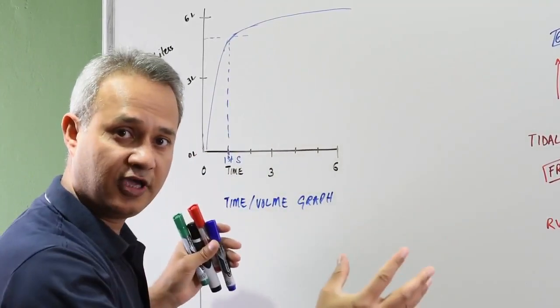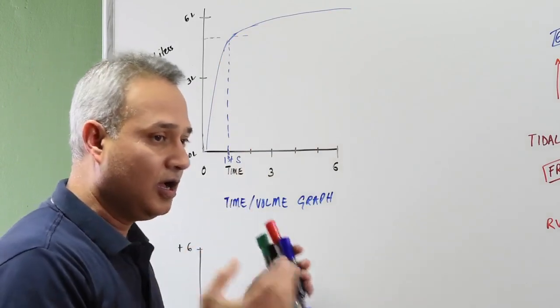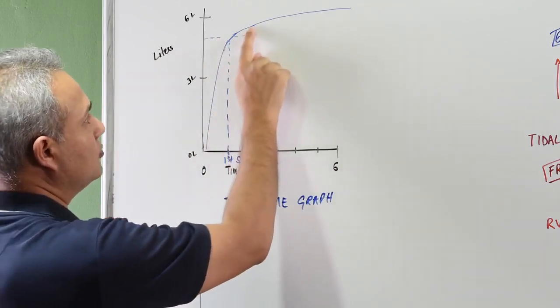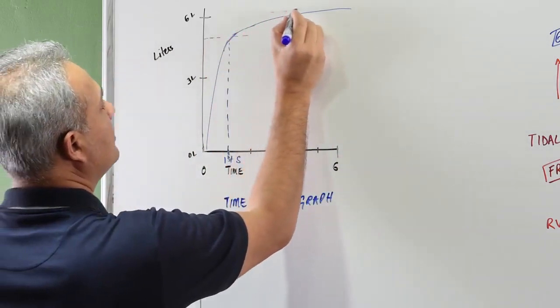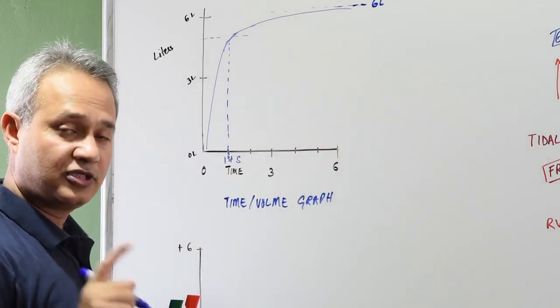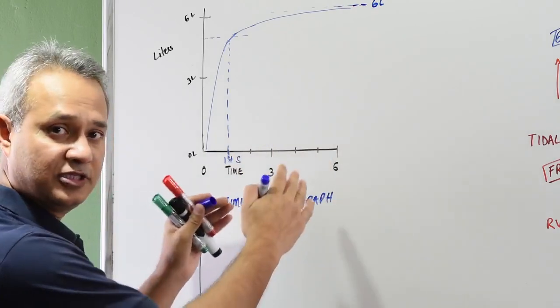A lot of the air has been expelled in the first second, and then in the rest of the seconds you keep going, but you cannot expel this much. You would just gradually keep expelling up to I believe 6 liters in healthy men. So this is the flow and the volume with the time.